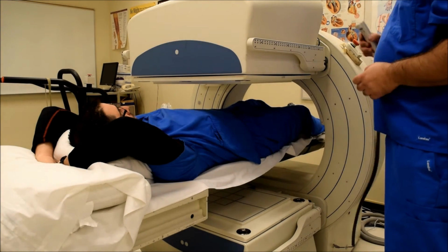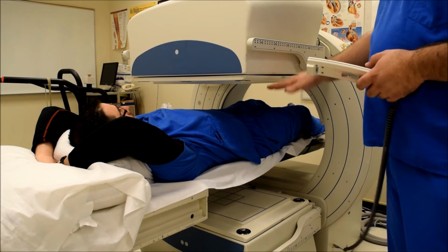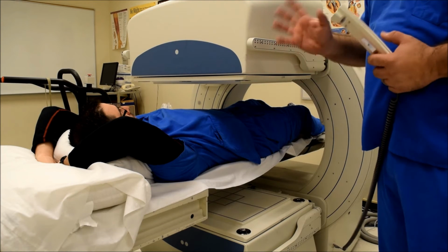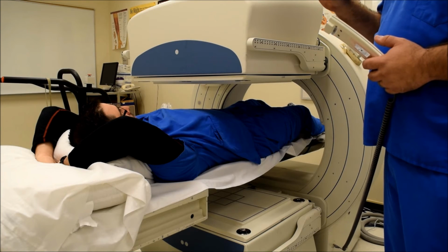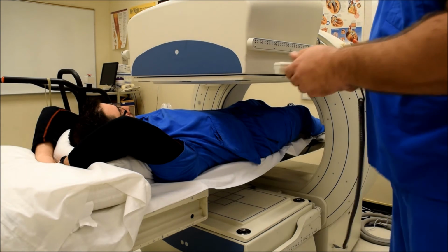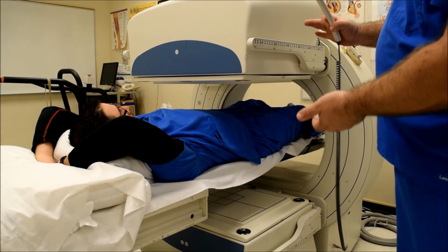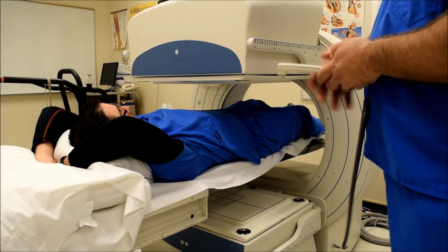For positioning of a SPECT bone scan, make sure the patient's in the middle of the field of view. The bed's up high enough to be in the center of the cameras, because the camera is going to turn 360 degrees around it, and you want to make sure the picture's in the center of the camera the whole time. You want to bring the heads in close enough to clear the table, but also as close to the patient as possible.